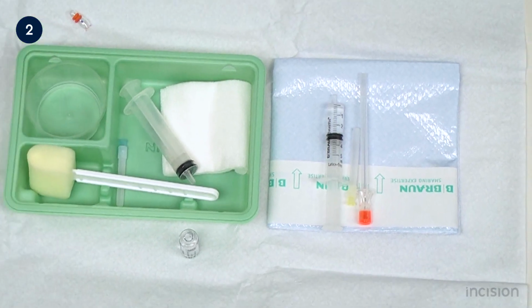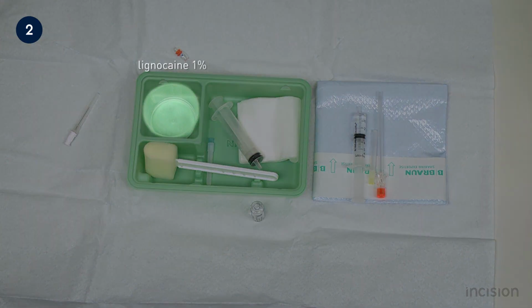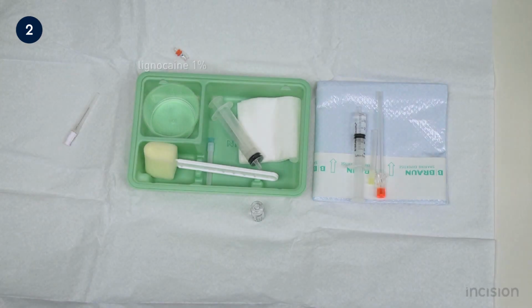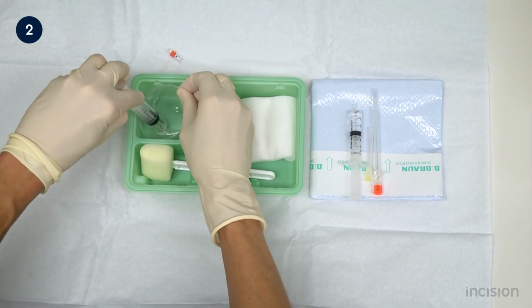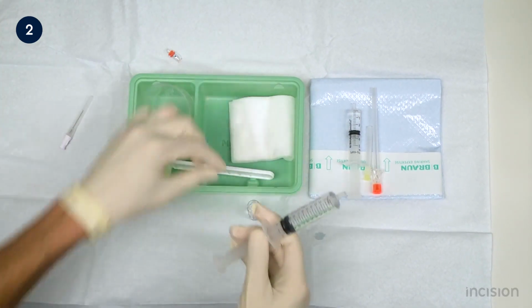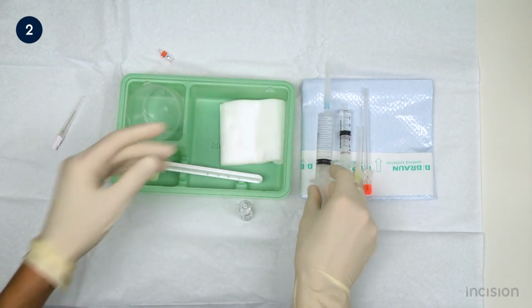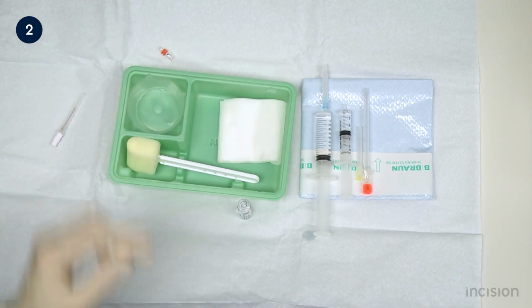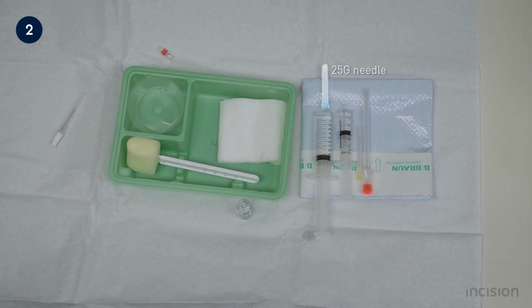With implements for intrathecal injection prepared, attention is now turned to the local anesthetic used to infiltrate the skin. The previously decanted lignocaine is now drawn up. This quick onset, short-acting local anesthetic is not routinely used intrathecally. Because of differences in duration of action, dosing, and potential toxicity, care should be taken to differentiate between the intrathecal and intradermal local anesthetic. Here, for example, lignocaine is drawn up in a 10 milliliter syringe and is capped with the needle that will be used to infiltrate the skin.